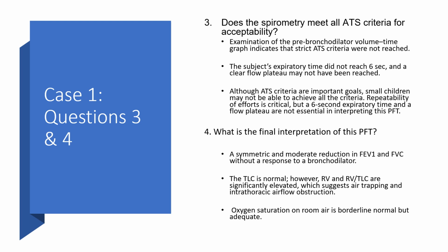Repeatability of the efforts is crucial, but a 6-second expiratory time and a flow plateau are not. So again, we look at the interpretation in view of acceptability from ATS criteria more liberally than we would with adults. The last question before we move on to the next case study is, what is the final interpretation of this PFT?